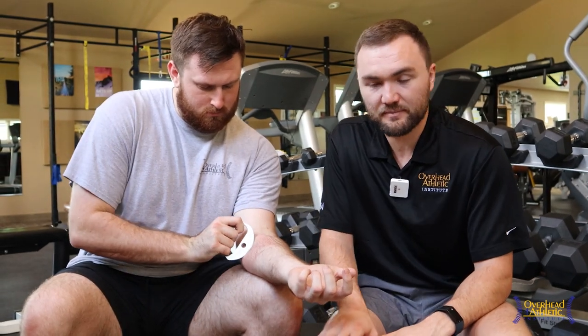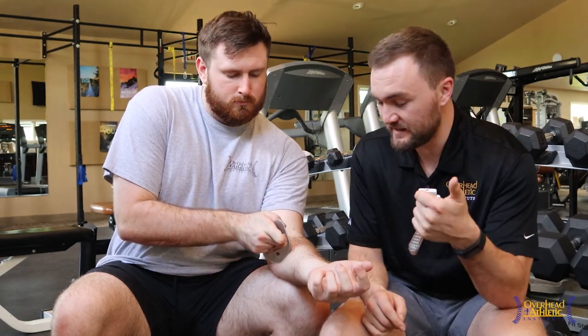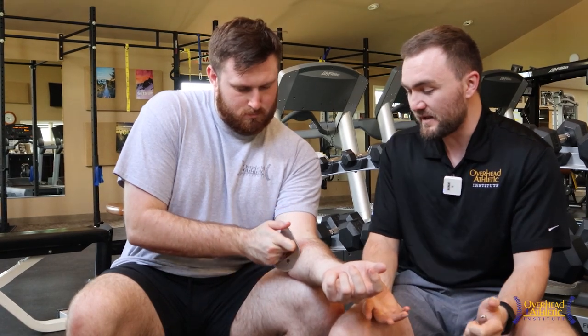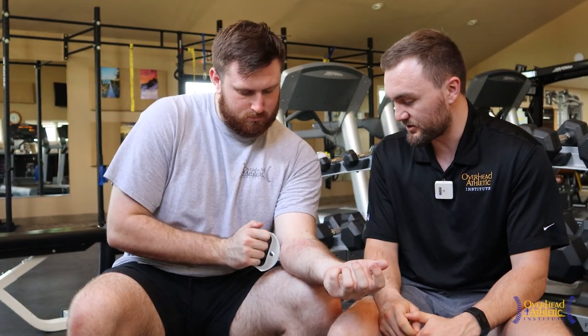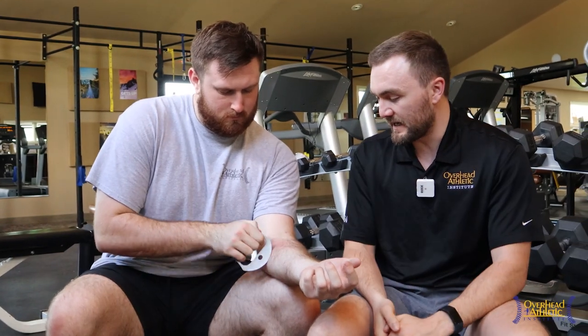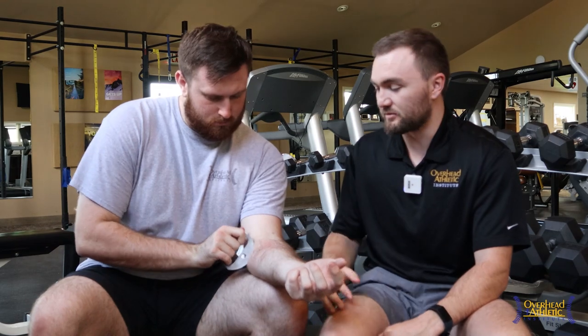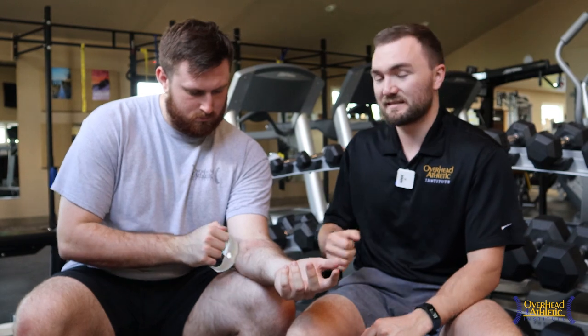Your dosage is usually about five minutes, at most ten. Just working through some of these sore tissues — we see that it decreases soreness, brings blood into the area, improves some sliding surfaces, and it may in fact even help the tissue heal a little bit and the collagen fibers to lay down in a more tightly compact fashion. So great for the elbow, great for the quads, great for the patellar tendon. After pitching, we'll spend a lot of time on the medial elbow doing this.